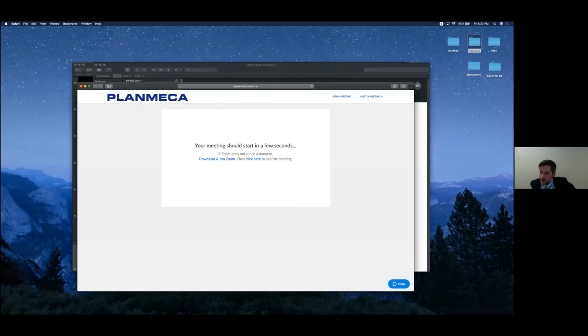Radiologists take more time and detail to go through a scan. How much time would you expect a dentist to spend on their first review of an image of both arches only while the patient's there? Is 2 or 3 minutes fair? I think if you were to just make a couple passes through the different views with the patient sitting in the chair, you're not writing a report. You're just commenting on what you see in terms of apical lesions or PDL widening. So I would say less than 5 minutes is fair, because you're not taking all of those additional steps to review and to write the report.